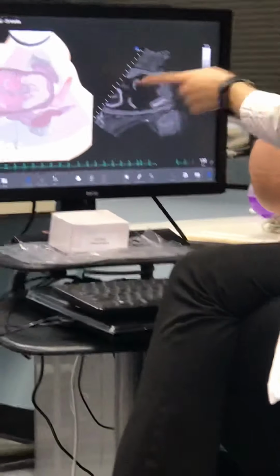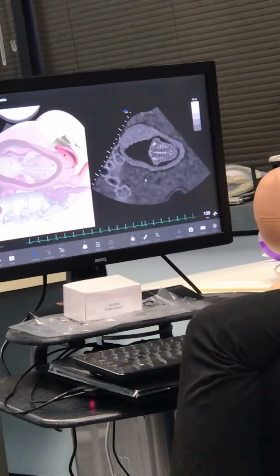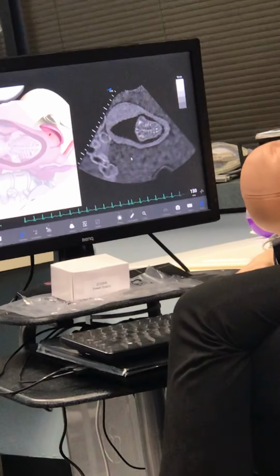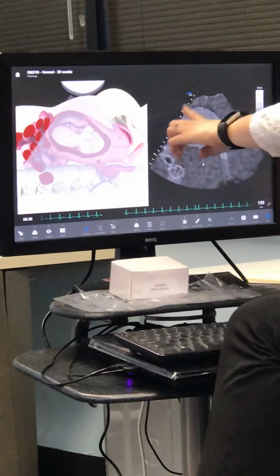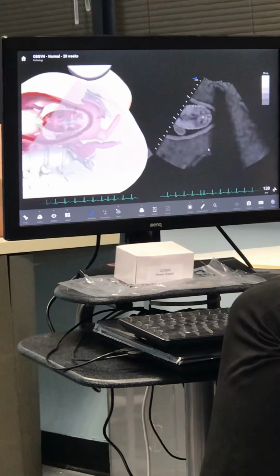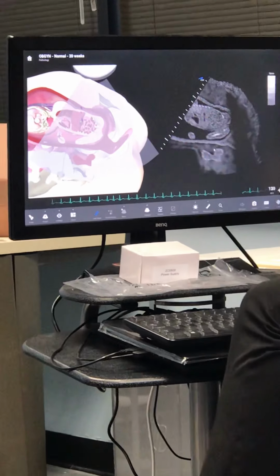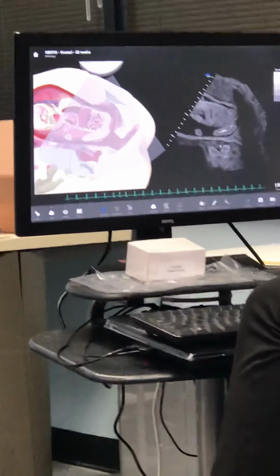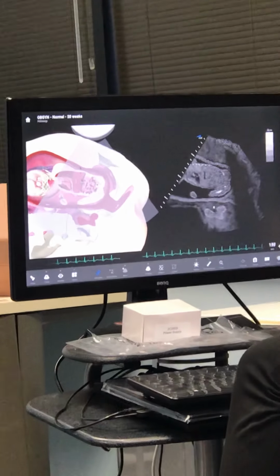Okay, so that would be you do lower, and then if I wanted upper, I would scoop. Okay. So if you can't see the little baby portions and you can cut through the baby's neck, that's not there. So you just measure from the biggest point. Yeah. So I'm upper because I can see my upper margin here. I'll measure there. For my lower, I should be able to see like cervix portion here, so I can measure down here. Does that make sense? Kind of, sort of, ish. Mhm. It'll be much more obvious when you're on a fetus that's larger.